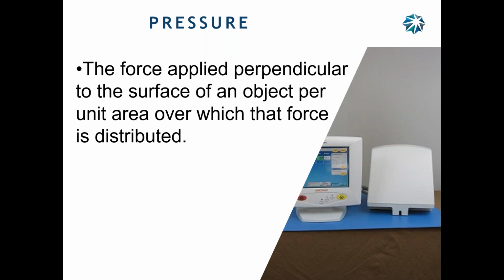So you're taking a syringe that holds 200 milliliters of fluid, something just like this, and you're trying to push it through the small tubing, the IV tubing. Where's the pressure at? What is going to push that fluid through that tube? The plunger. What's pushing the plunger?